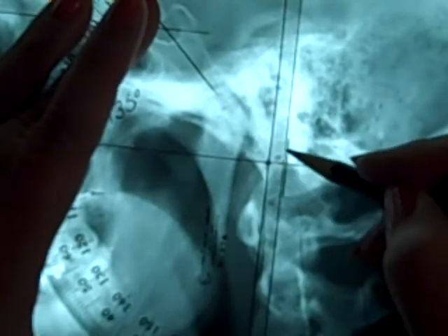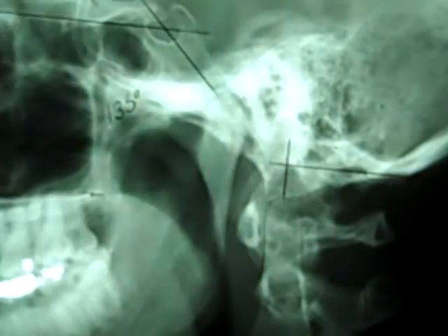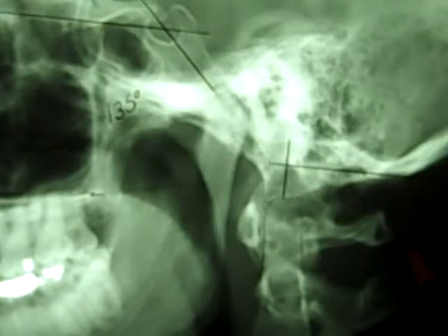So I'll draw this one like that. McRae's has 2 findings. The first finding is that you should see some bony tissue below the line, and I do. That's the first part. And we do.